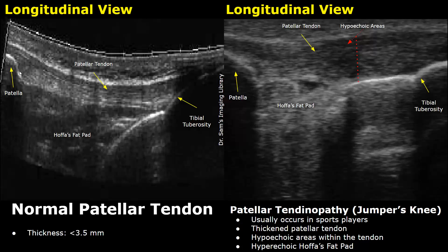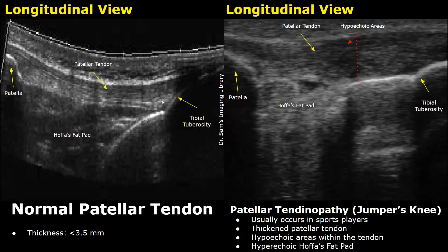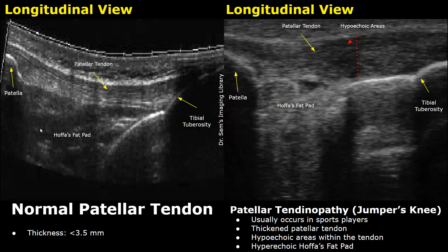This hyperechoic structure is the patella, the kneecap, with posterior shadowing because it is a bone. Over here this is the tibia — the tibial tuberosity — where the patellar tendon attaches to the tibia. This area is the Hofas fat pad. It is located posterior to the patellar tendon and is mainly a hypoechoic structure.